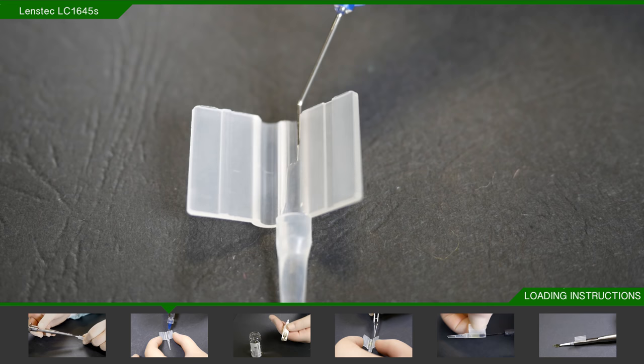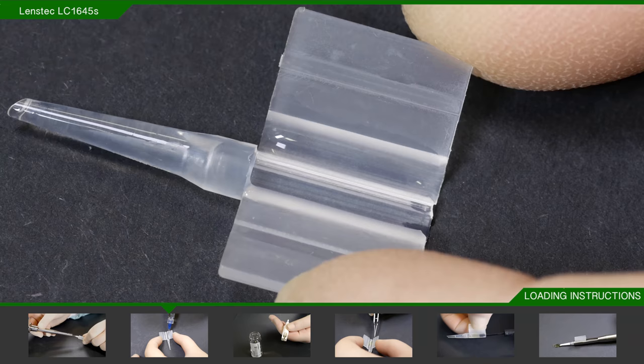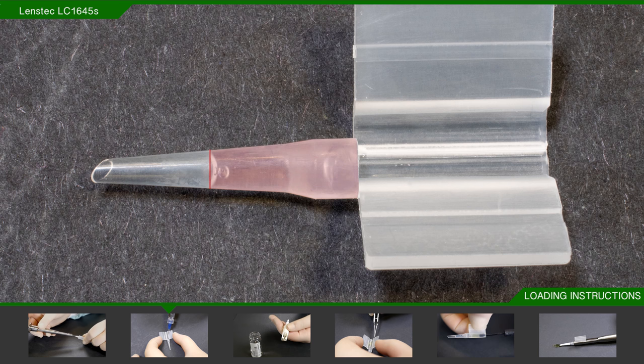Fill the barrel and both channels of the loading chamber with saline. Then inject viscoelastic into the barrel from the loading chamber side, filling it halfway.